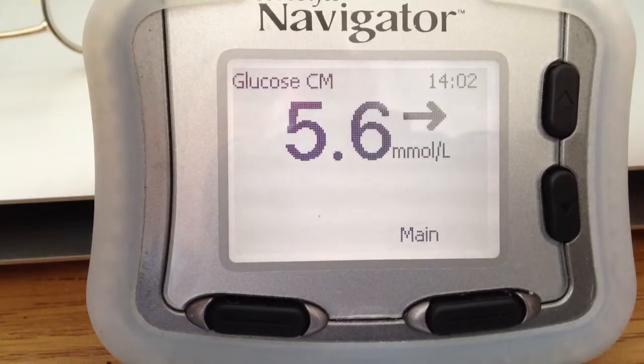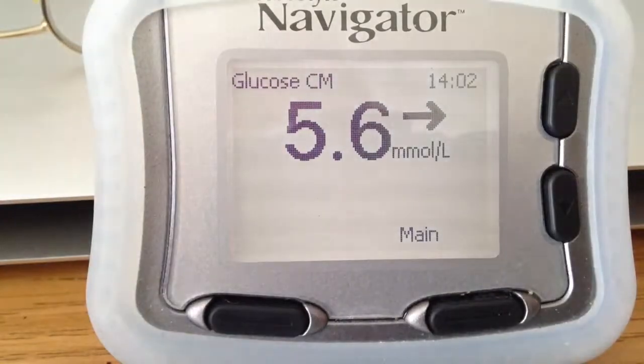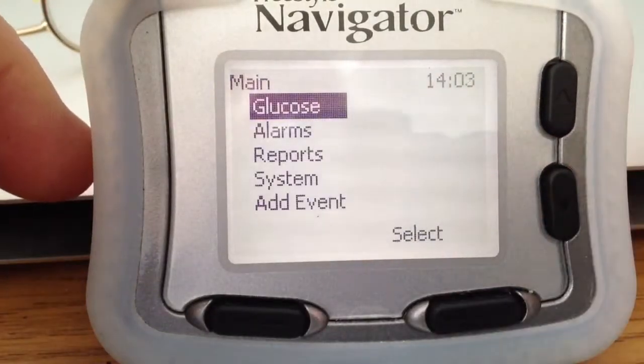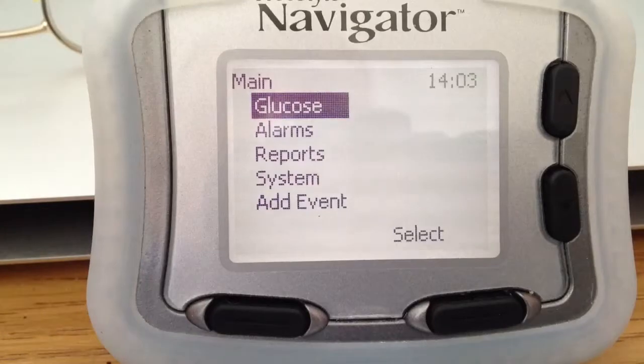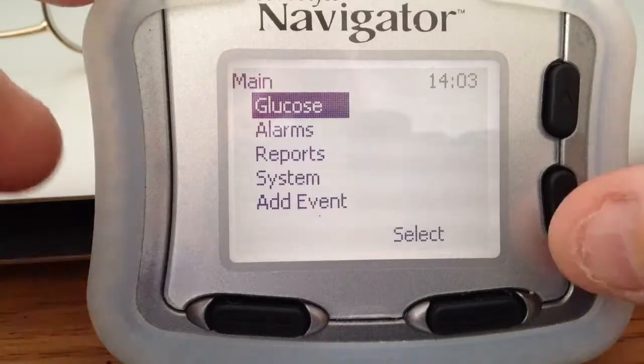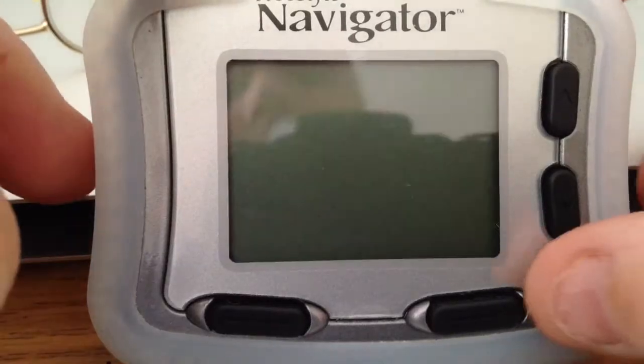and it's normally updating every 1 minute, or at least this model is, the Abbott FreeStyle Navigator. So you can see a very good trend. Whereas normally if you were testing your blood sugar with a blood glucose meter, finger stick pricker, then you'd probably be testing 6 to 10 times a day. Whereas with this, you're testing effectively 60 times an hour, 24 hours a day.